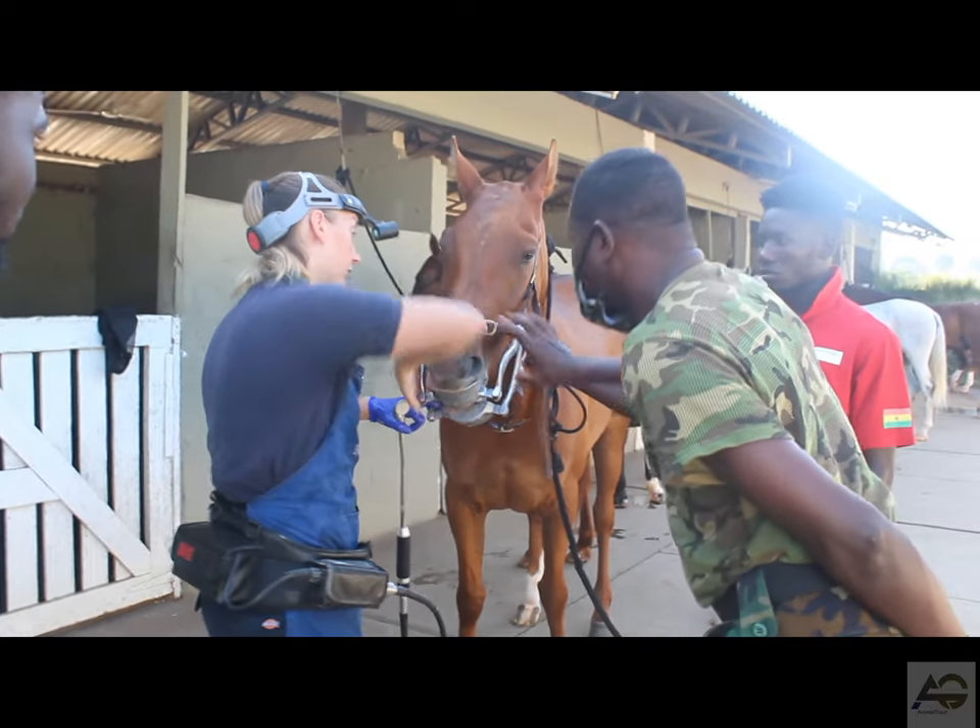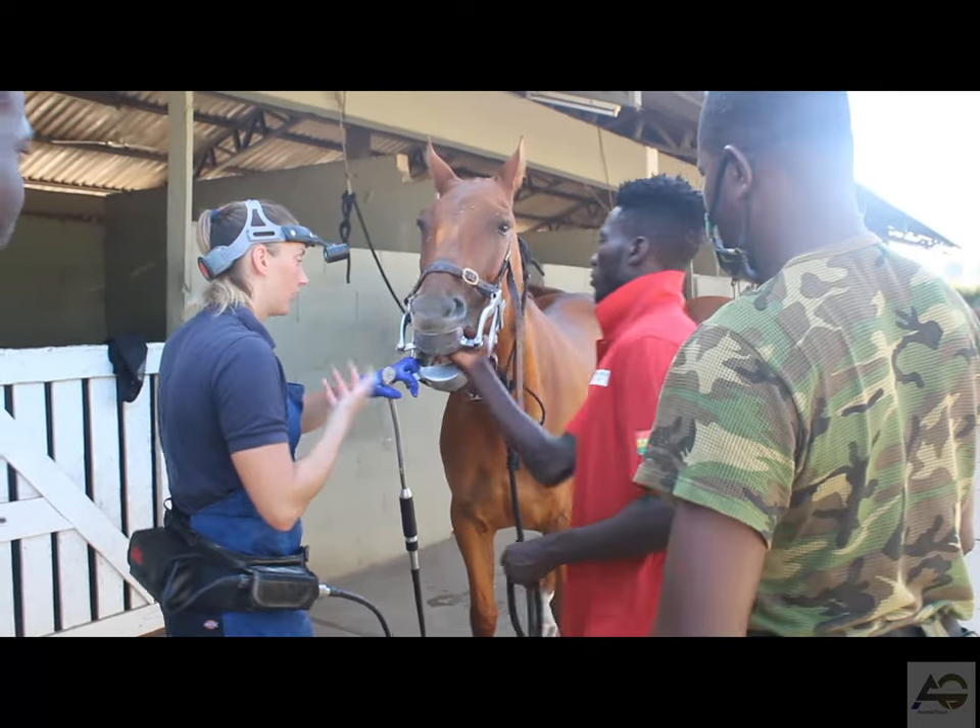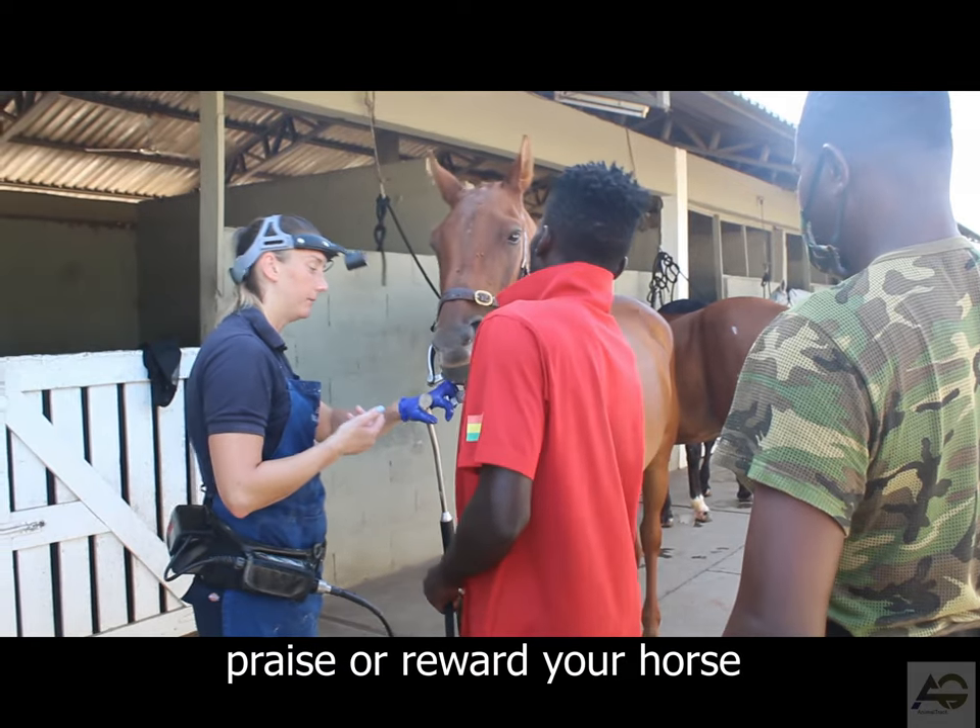Step 6: Finishing up. Once you have finished floating the teeth, it's important to praise the horse and offer them a treat as a reward for their cooperation.